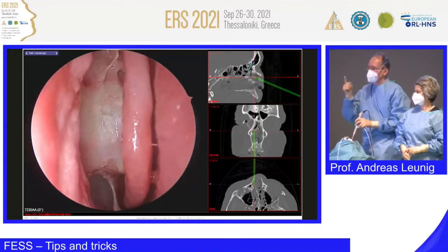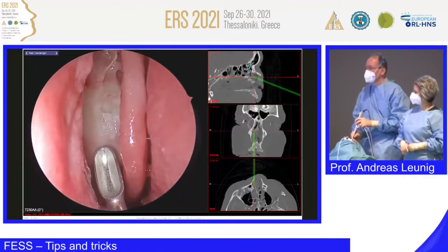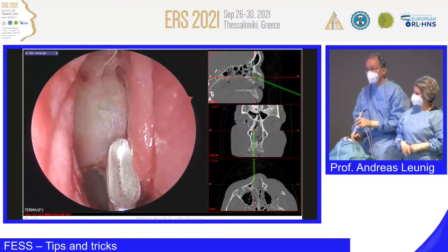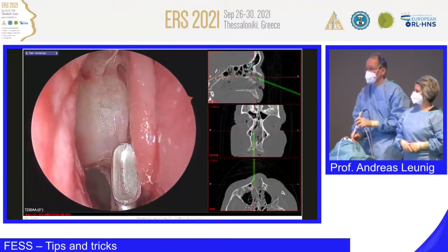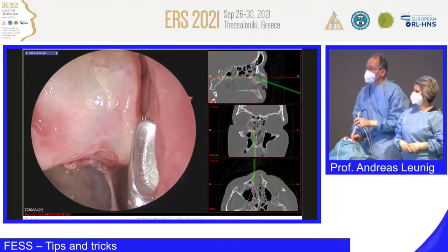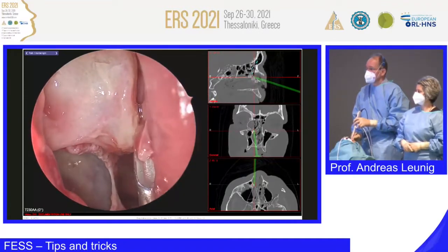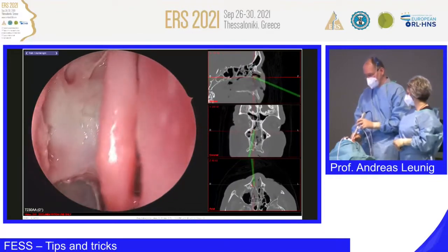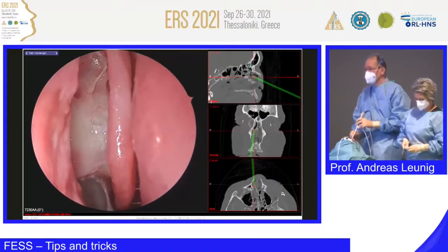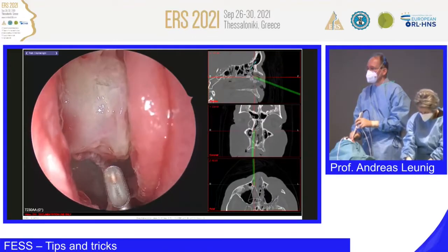So, now, we are facing the ethmoidal bulla, Cottle spoon. We are going in very gently. This is our friend, the middle turbinate. We don't harm the middle turbinate. We leave it in place. Now, this is here the space between the ethmoidal bulla and the middle turbinate. And there are some remnants here. I want to take it out. I always want to have a clean surgical field. Should be nice. I don't want to fracture a lot of bony lamellas and leave them inside, no.